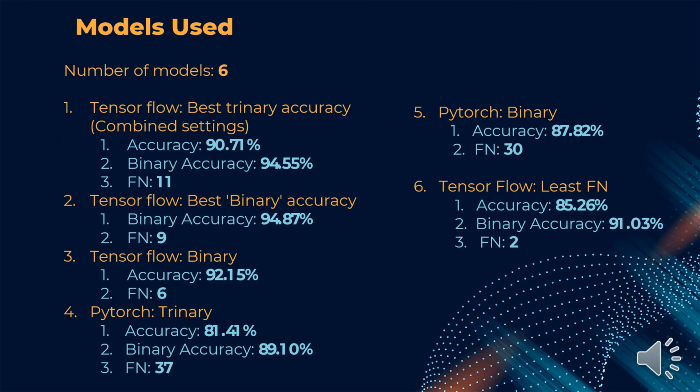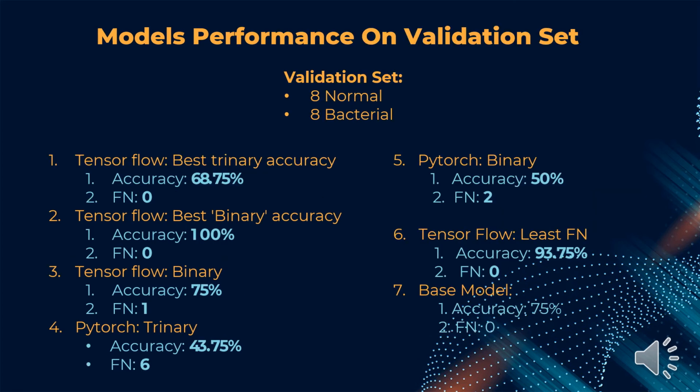After being met with initial success with our models, Dr. Yu encouraged us to expand the breadth of models that we used with our project. And as you can see, we found several settings and configurations that were suitable for us. Here's a brief overview of the performance of our networks when tested against the validation set. This is in contrast to the performance of the base model, which, as you can see, we've greatly outperformed in several cases.